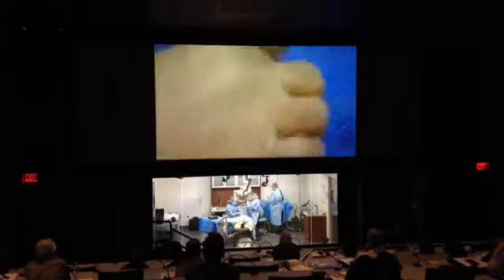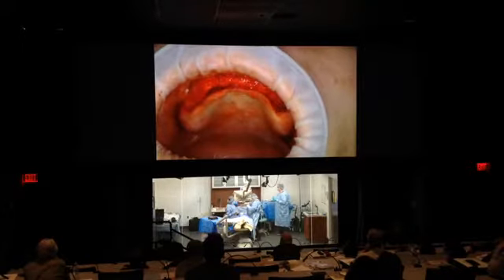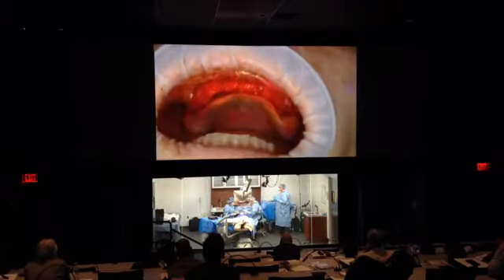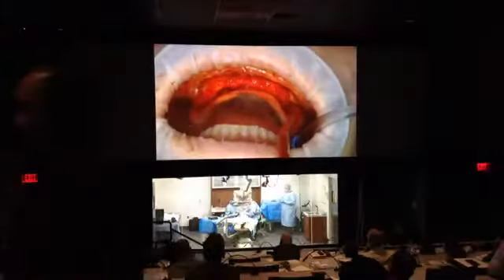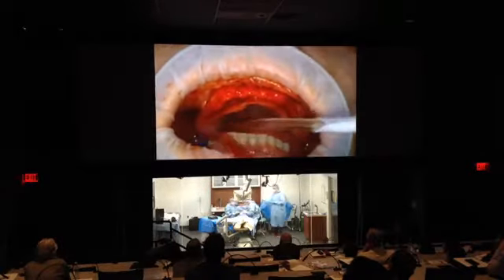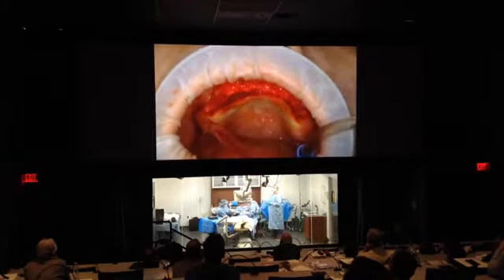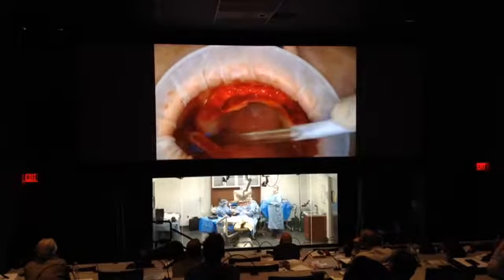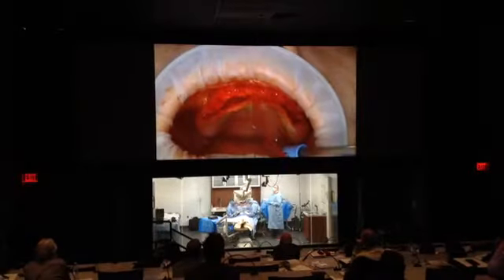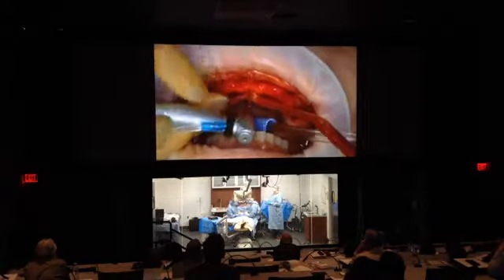All right, so let's place this. I'm going to use a 2mm twist drill right in the midline. Oh, these glasses are hanging a little on your eyes. Okay. I'm going to get a little bit of water, okay? I need a little more water than this. Especially when somebody's sedated, you don't want to have too much water, but not too little, because that could burn the bone. So here we go. I like that. Every detail counts with implant surgery. Okay. So we're going to go here right in the midline for her.